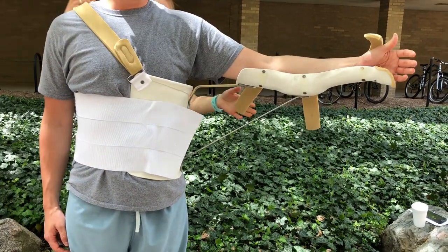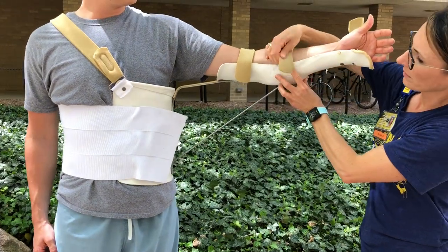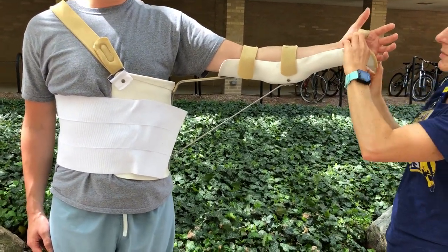Secure all of your arm straps. The bum should be pointed up towards the ceiling, and then the last strap can be put in place.